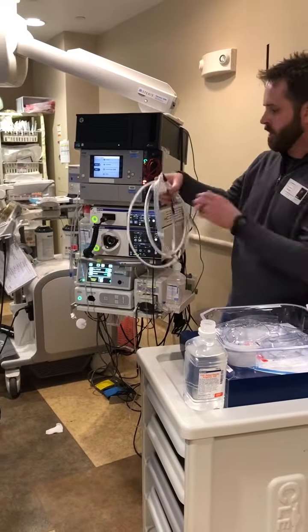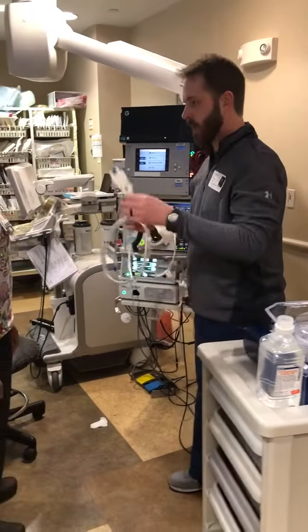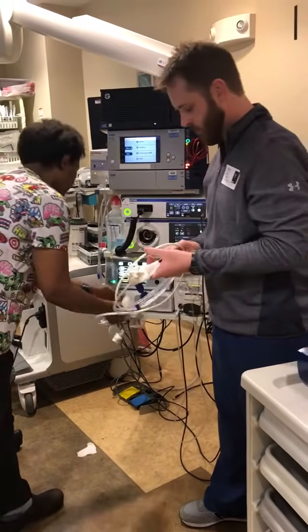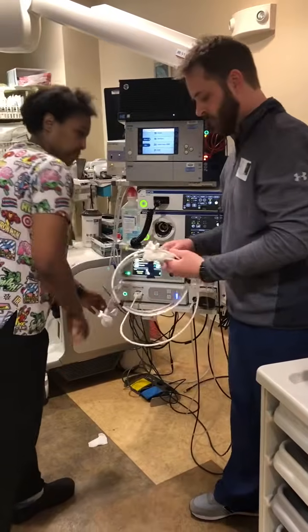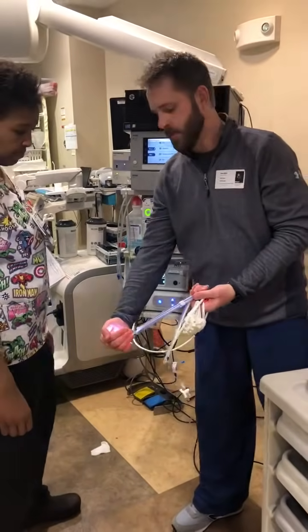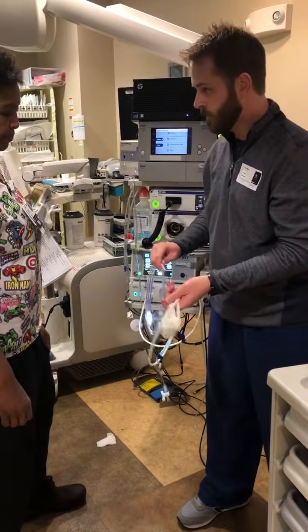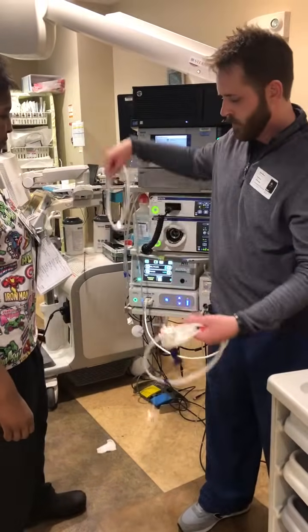So spy comes out. There's a white cord with a blue arrow on top that plugs into the console, if you would. The Spyglass catheter comes as soon as it lights up. You're in good shape. You know that it's on and working. It comes in a hula hoop. We're just going to pull off the hula hoop.